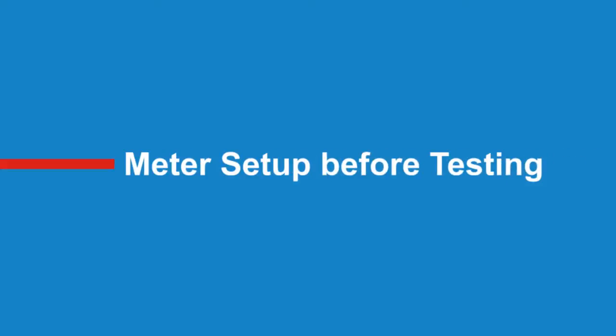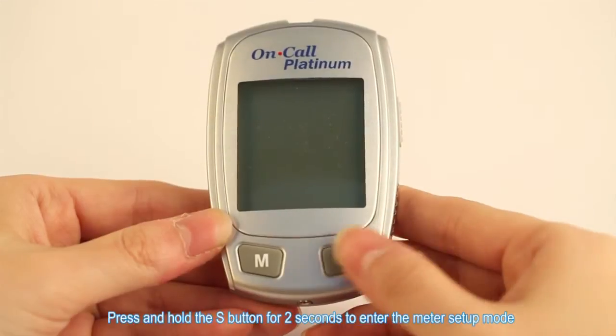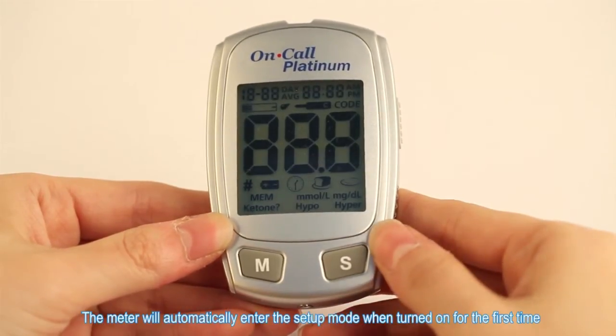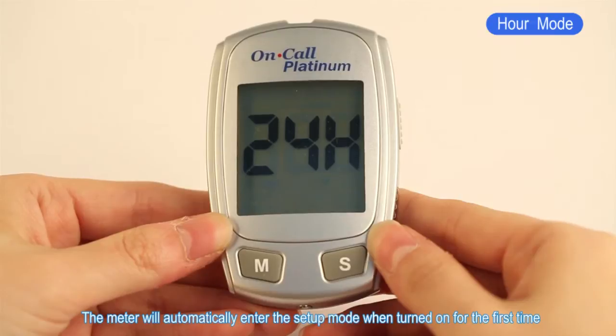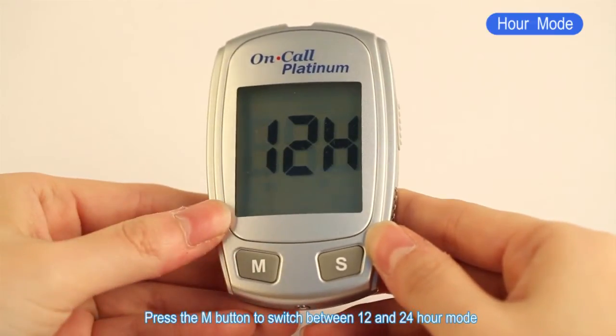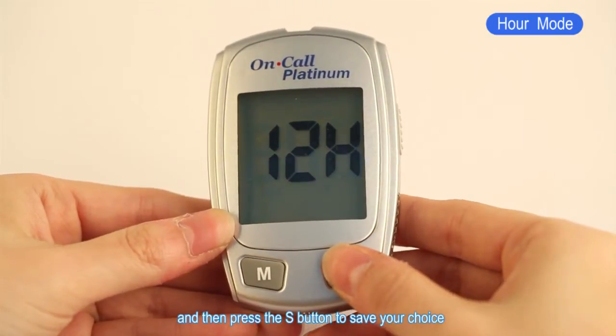Meter setup before testing. Press and hold the S button for two seconds to enter the meter setup mode. The meter will automatically enter the setup mode when turned on for the first time. Press the M button to switch between 12 and 24 hour mode, then press the S button to save your choice.